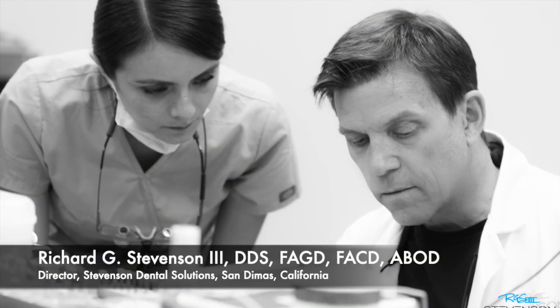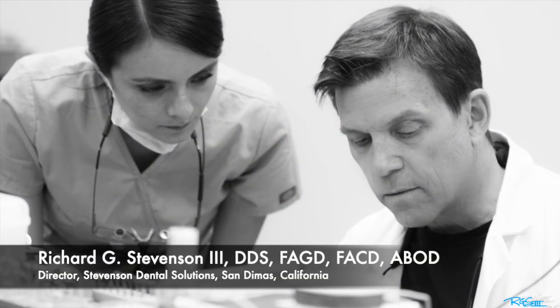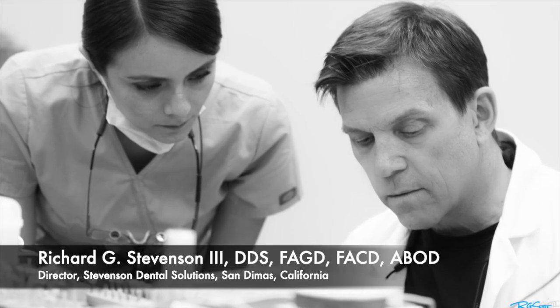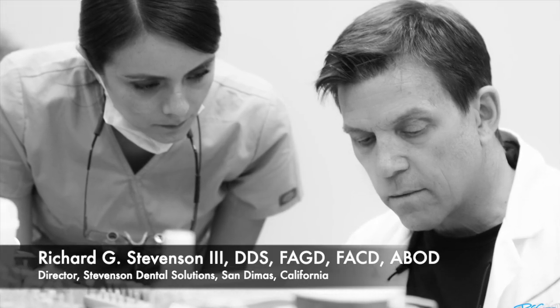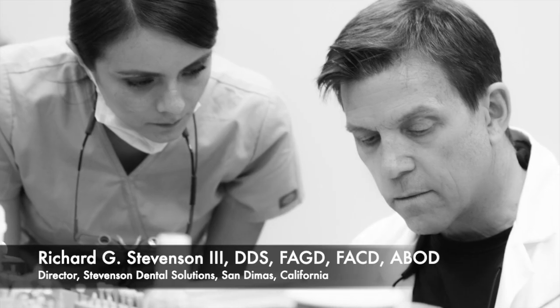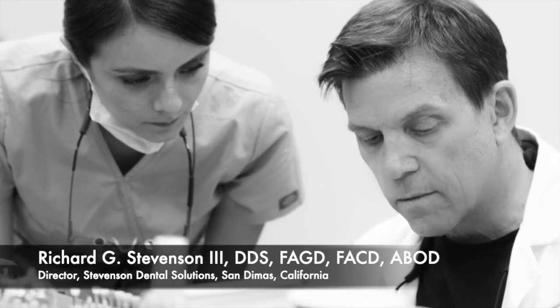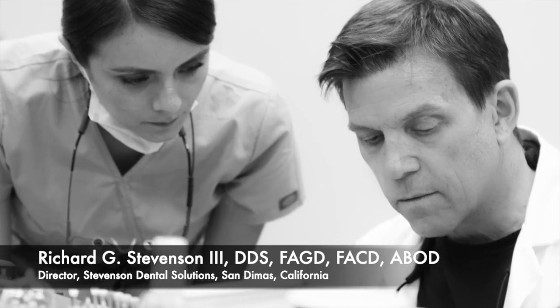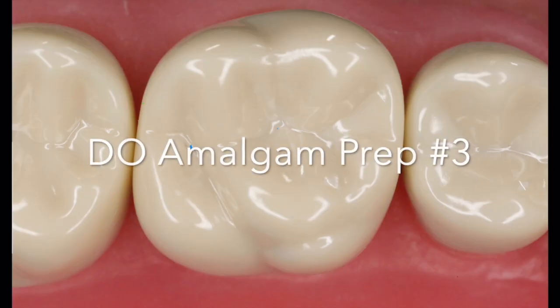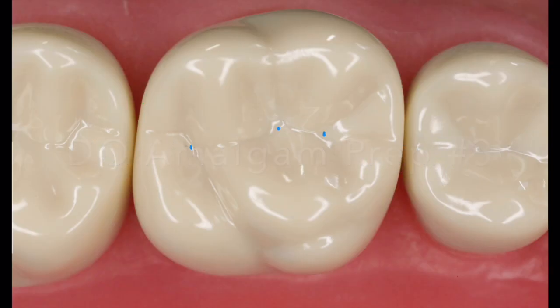Hi everybody, I'm Dr. Richard Stevenson and I'm the director of Stevenson Dental Solutions in San Dimas, California. We are a teaching center that focuses on skills enhancement and overall knowledge improvement in dentistry, and today we're going to tackle the DO on tooth number three Columbia typodont.